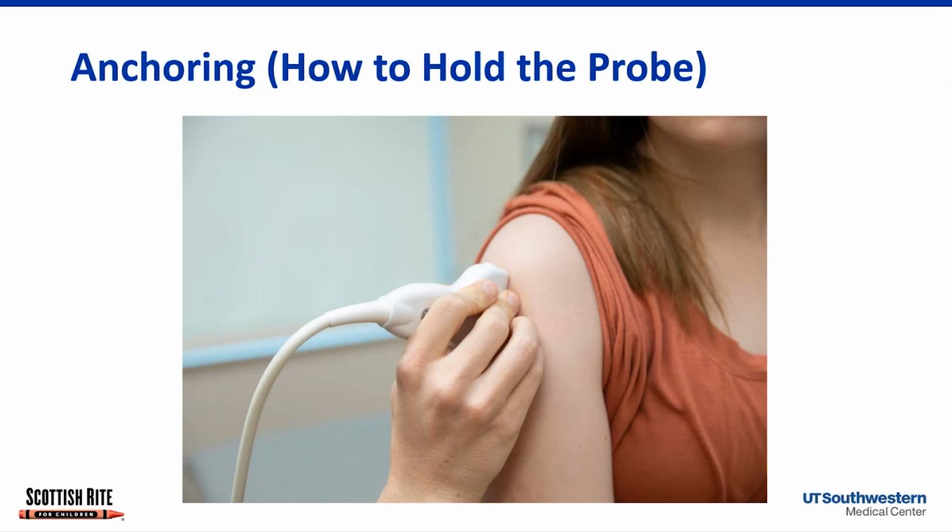You have this probe, this transducer, and you have gel, which is like a lubricant, so it can get really slippery. So we use the word anchoring because you really want to anchor down on that patient to make sure that you're not slipping and sliding all the way.